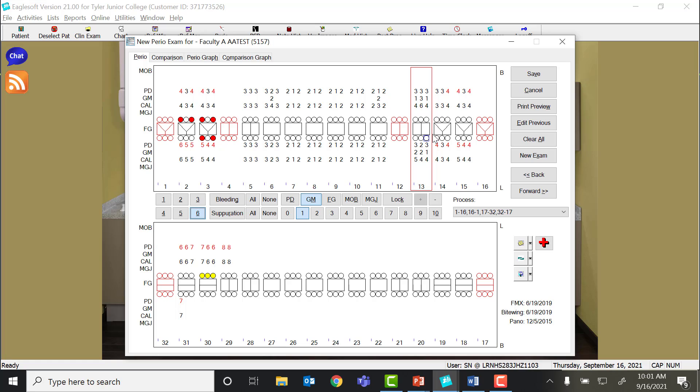What I want you to look at with this number, let's tap on number 13 where I've put recession around the entire tooth. Notice that the PD, the probe depth here on the side, is 3. I've put in the gingival margin as recession as a 1-3-1, and that changed the clinical attachment level to 4-6-4.